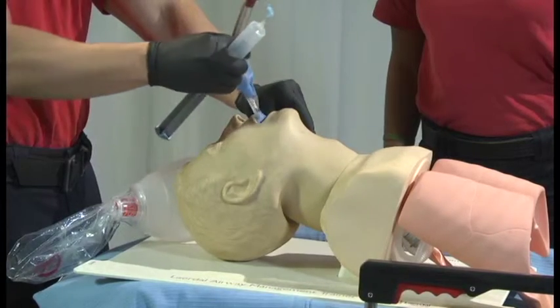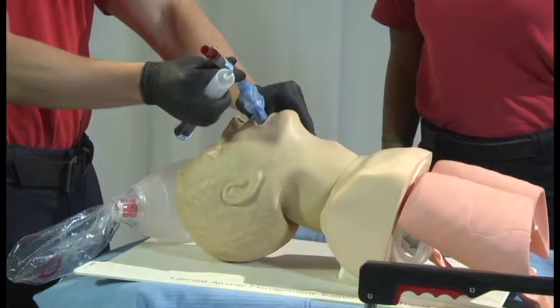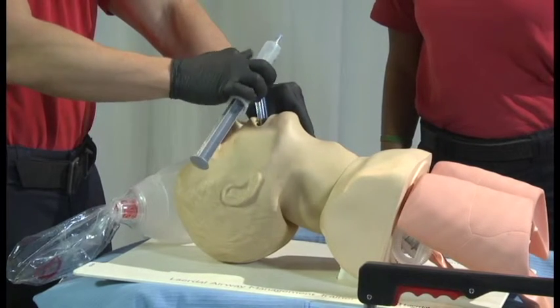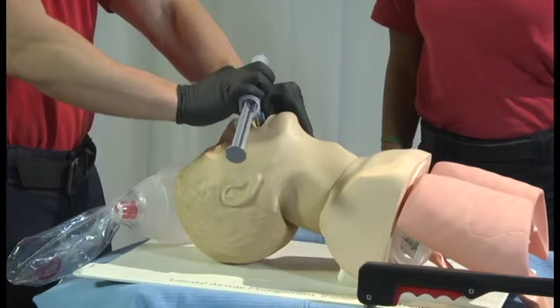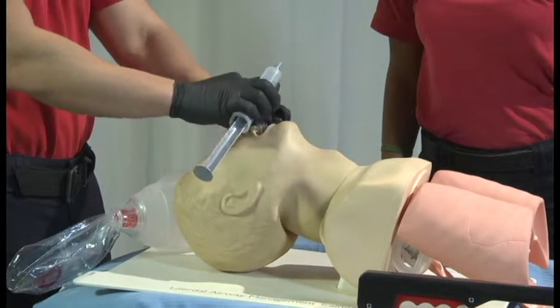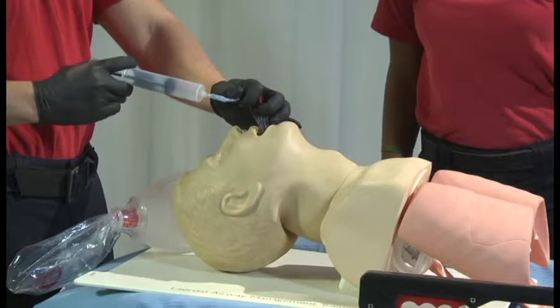King airways can be placed with the head in a neutral position using a scissor technique to open the airway. Begin insertion with the airway device rotated laterally as shown. As the distal tip passes under the tongue, rotate the device back to midline and advance without exerting excessive force. Insert the device to a depth that aligns the base of the connector with the teeth or gum line.